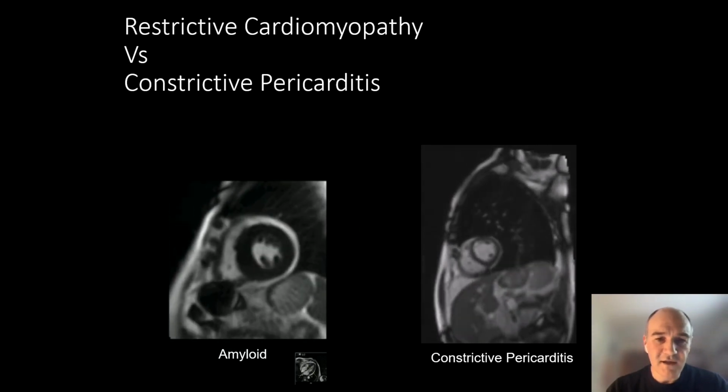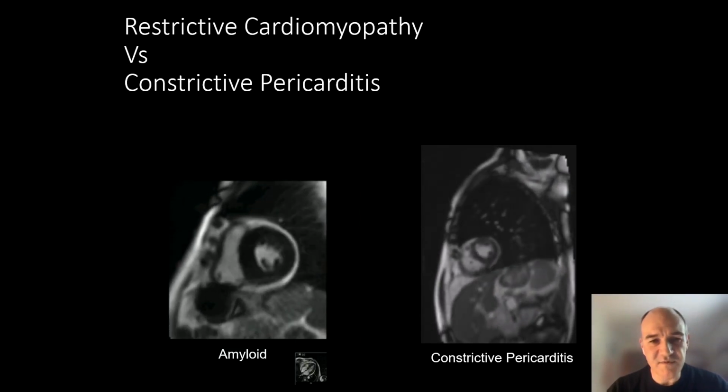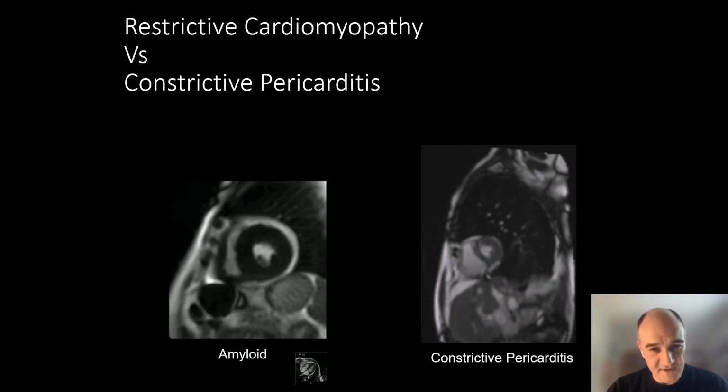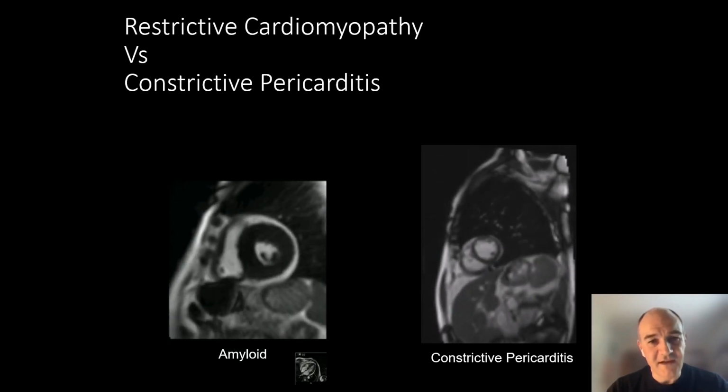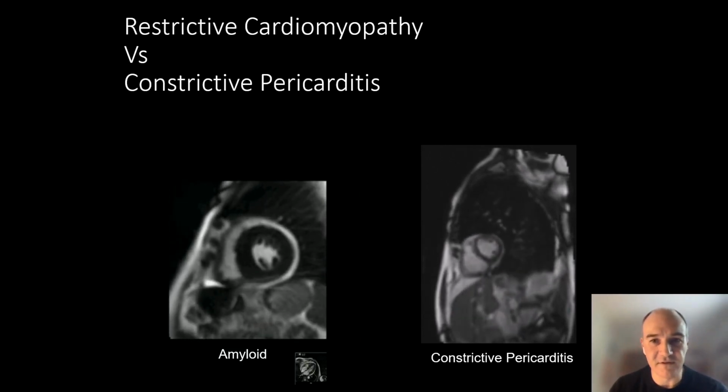So we are not infrequently asked, in patients who've got pericardial calcification on CT and symptoms of constrictive pericarditis, to do an MRI to see if we can demonstrate this ventricular coupling and the likely physiological impact of constrictive pericarditis.